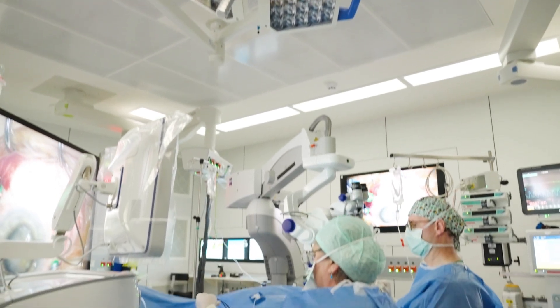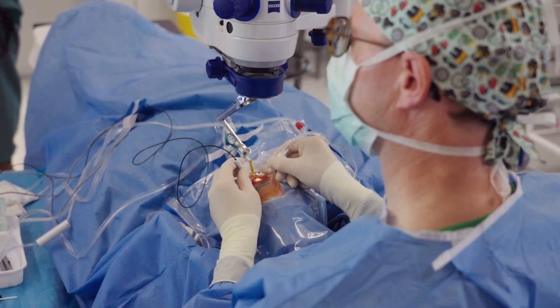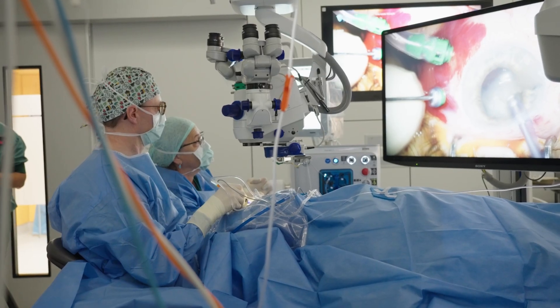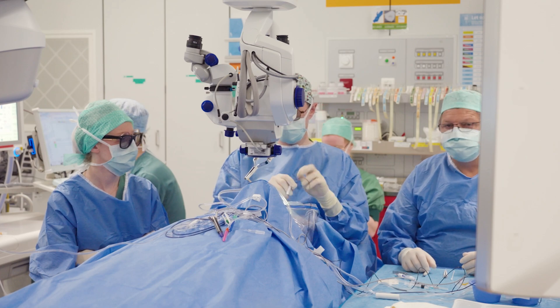A microscope is somewhat like a chain of a bike — it's the weakest link that determines your image quality. And so every time when I switch from a reusable to a disposable lens, the whole OR goes like, oh my god, this is so much better.